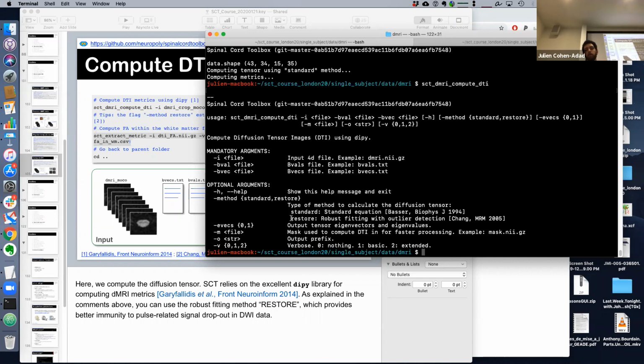I just used the average residuals in the entire cord mask in my original paper. Okay, sure, there might be smarter ways. We can look into that, but my experience is that it does deal pretty well with a few outliers. But obviously, if half of the images are dark or artifacted, this is not going to work very well.